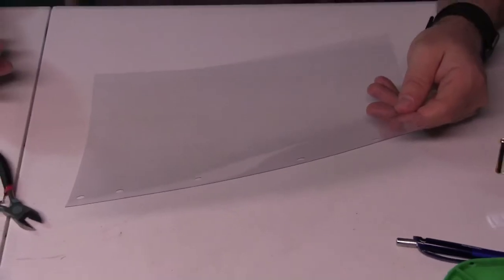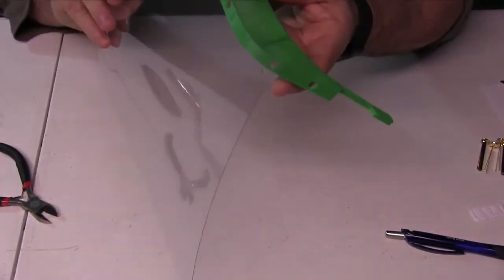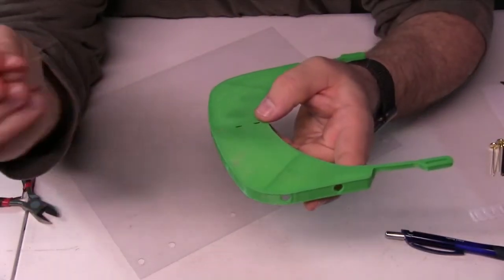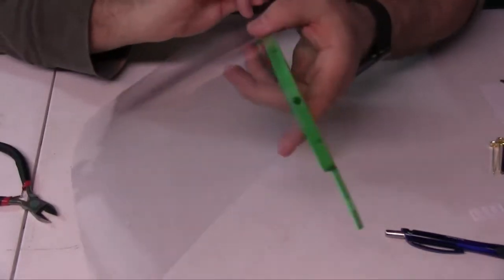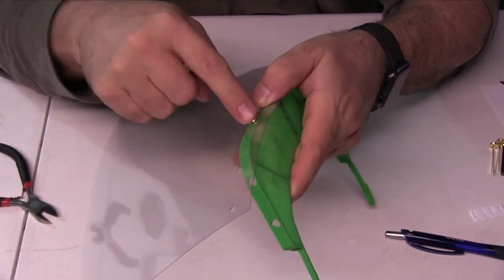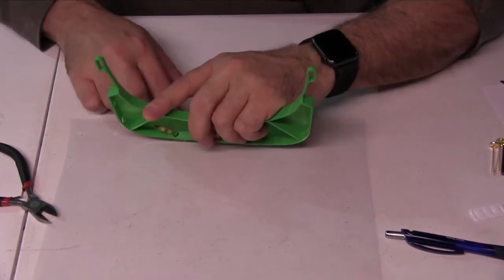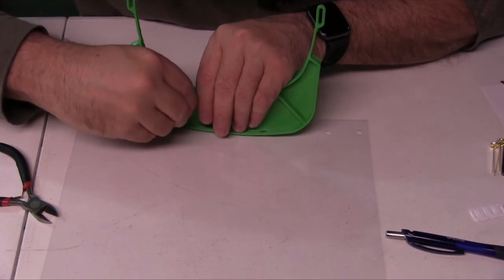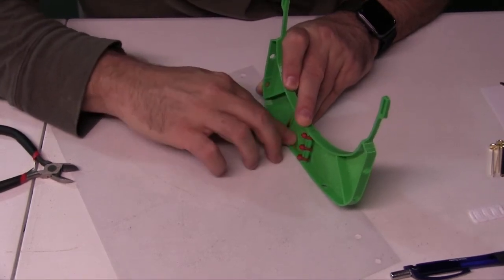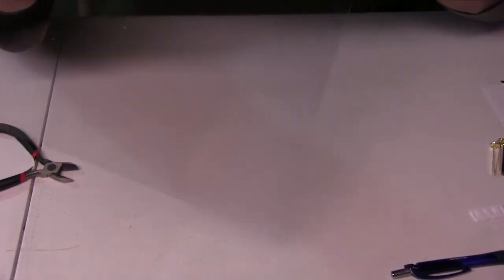So I'm going to back out a little bit here in the video, and now what I want to do is take the finished product here, and attach it. I'm going to attach this right here using the metal brads. The metal brads are going to go through the holes into the actual frame, you see them coming through the other side over there. And on the other side, we can then separate out the two pieces here. And you'll see that now the face shield is attached.